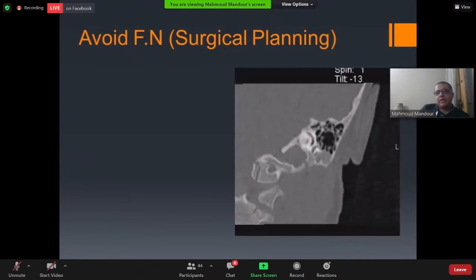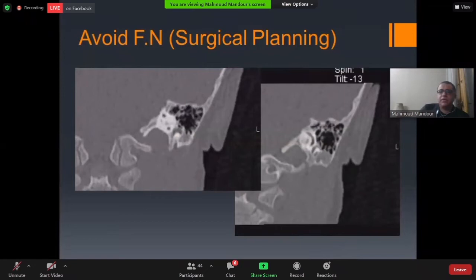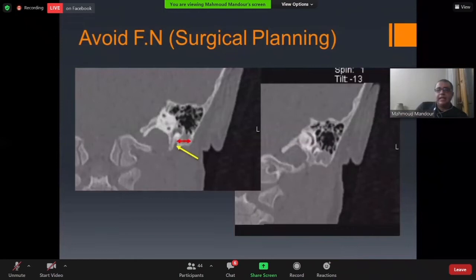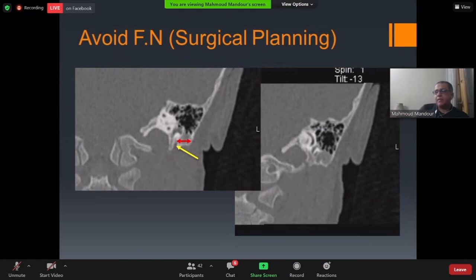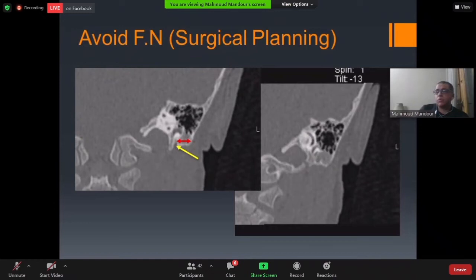In coronal cuts, we can identify the posterior semicircular canal serially and the facial nerve emerging from the stylomastoid foramen. An important point to check is whether there is sufficient bone thickness above the vertical part of the facial nerve — the mastoid is an inverted pyramid so near its apex the bone is thinnest. Favorable thickness is six millimeters or more for safe cortical mastoidectomy.